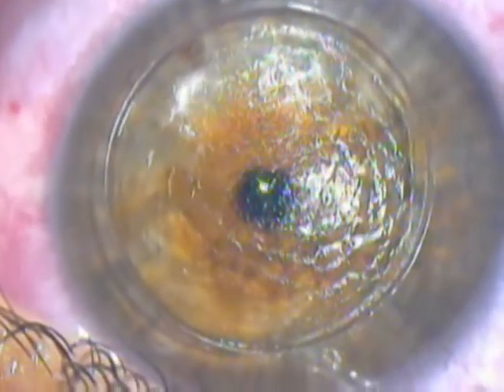We can already see the difference between one zone and the other that is clearly more regular, which is the main aim of this modification in the technique that we usually performed with the femtosecond laser.